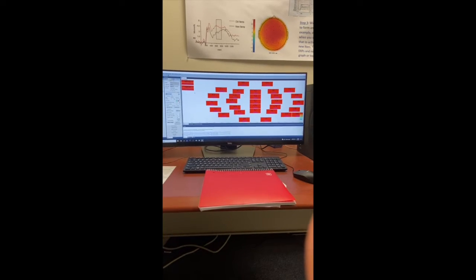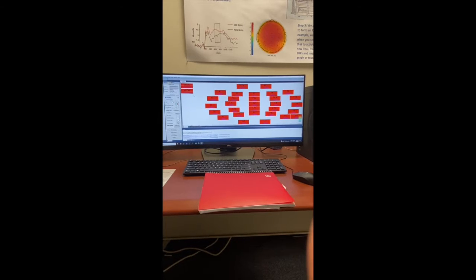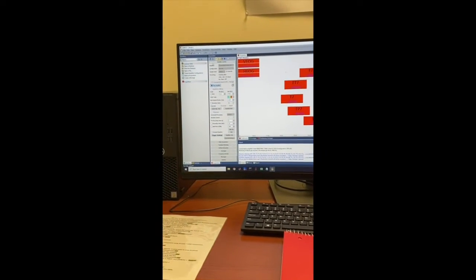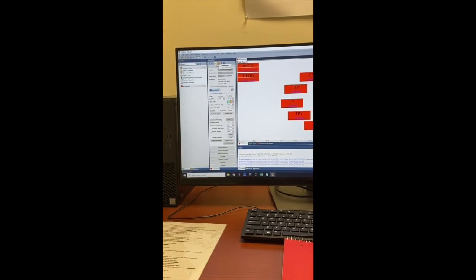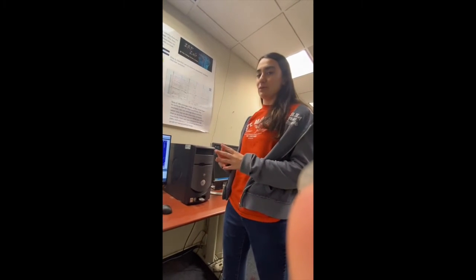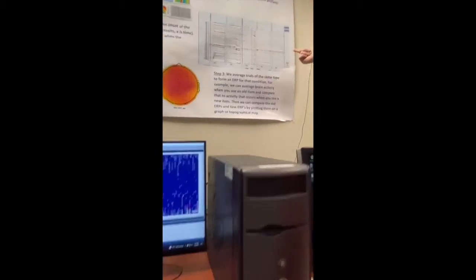Once you turn off the impedance check on OMI, the ERP recording computer, the participant's brain data should be visible. You will do that by pressing this omega symbol up here. Once that is done, you will be able to see the brainwaves. Please be aware that this is not a visual representation of the data because we don't have anyone plugged in at the moment, but it will instead look like these waves up here.